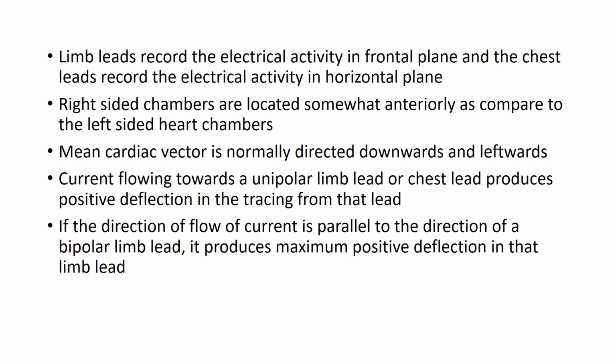Before jumping on to the interpretation of P wave, at this point I want the listeners and viewers to understand 5 basic concepts.